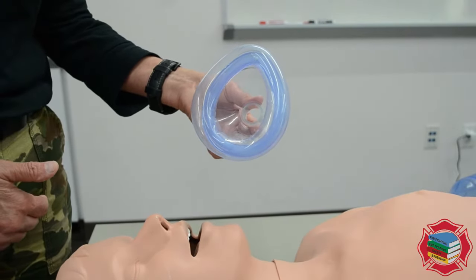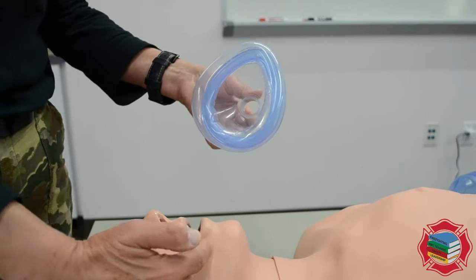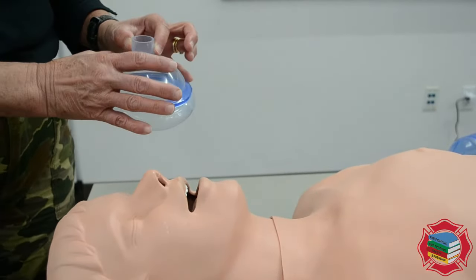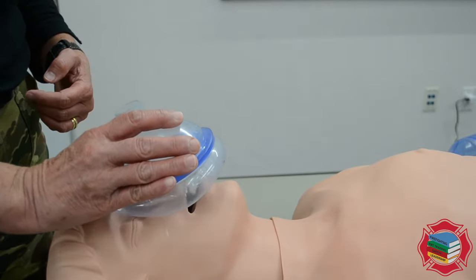When you're measuring a mask, be it a pocket mask or the mask that belongs with a bag valve mask, it should measure from the bridge of the nose to the cleft of the chin. When you place the mask on the patient, you're gonna place it with the apex — the pointy part — at the bridge of the nose.